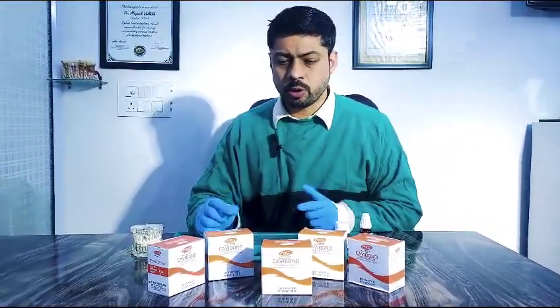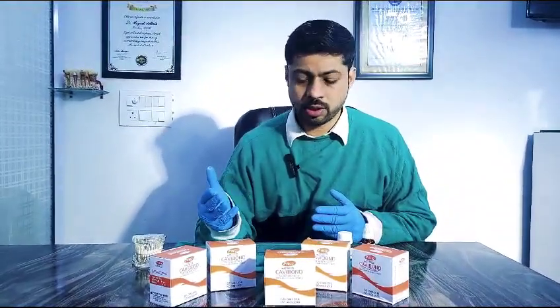I use this product for two things: one for temporary cementation — sometimes we have to give temporary crowns before the permanent one is available — and we can also use it for temporary restorations.